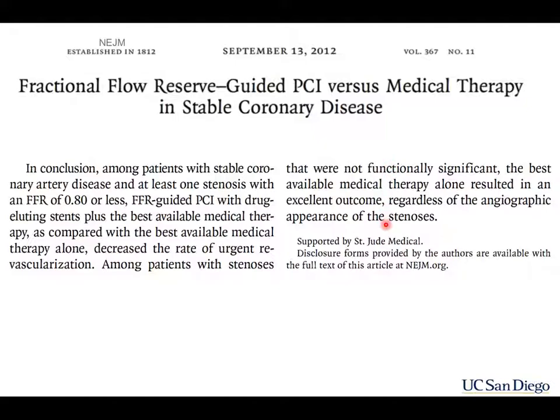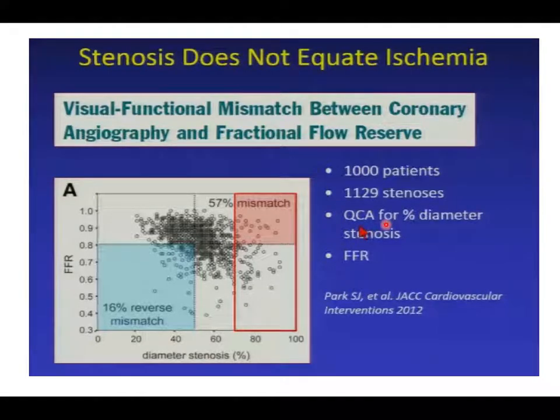This was done using very good X-ray angiography, and we'll study X-ray angiography later, to determine quantitatively what the geometric stenosis was in those patients. Like all biological data, this data is messy. 100% diameter stenosis means that vessel is entirely closed off. It just comes to a stop, and you don't see contrast distally. A 50% stenosis, you can imagine, has a 4 millimeter diameter, goes down to 2 millimeters, and then goes back up to 4.